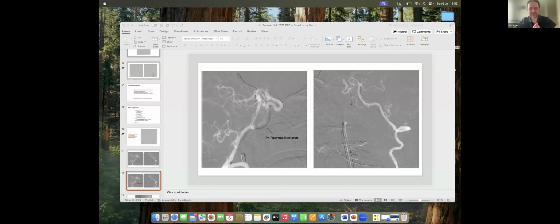I just wanted to emphasize the beauty of covered stents and grafts. These are beautiful devices. Of course, they are rigid and stiff, and there is a problem with the guide and the catheter. That's the reason why, about 20 years ago, I continued to ask the companies to make a covered flow diverter, which would be the perfect solution for this case.